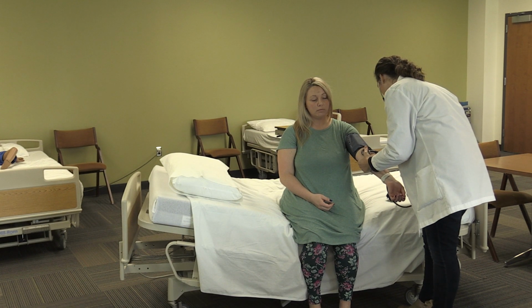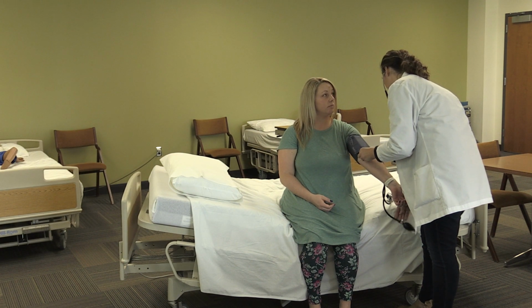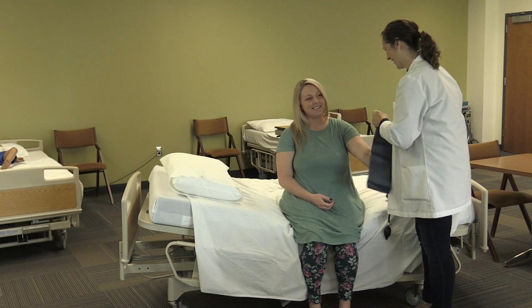Feel the cuff. Give your arm a little hug. Your blood pressure is excellent, 110/60. Good. That is excellent.